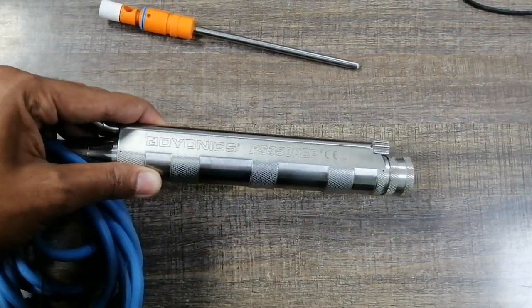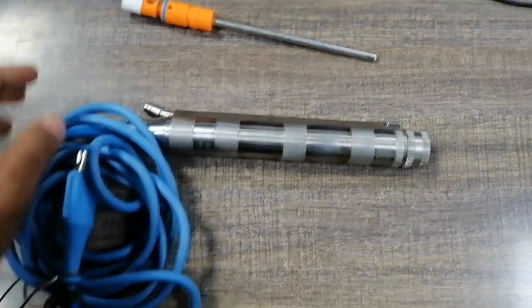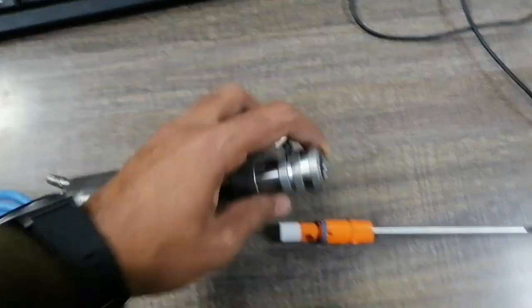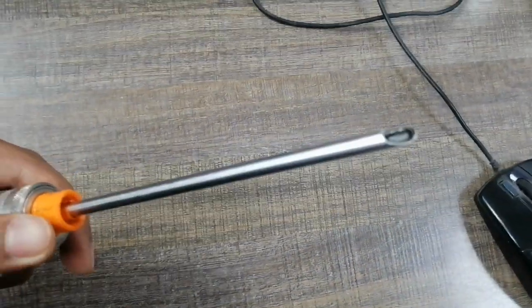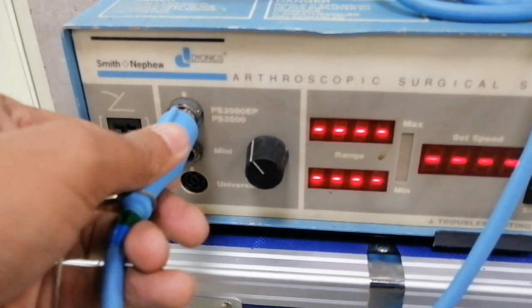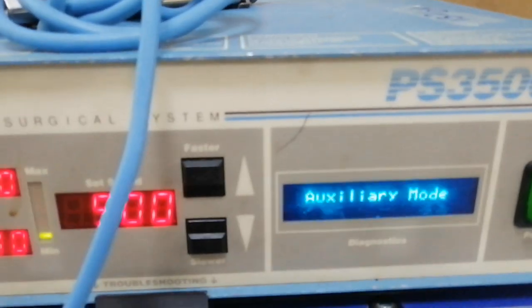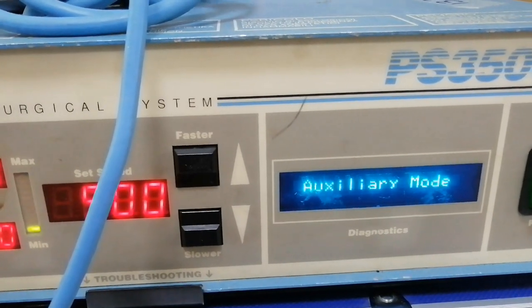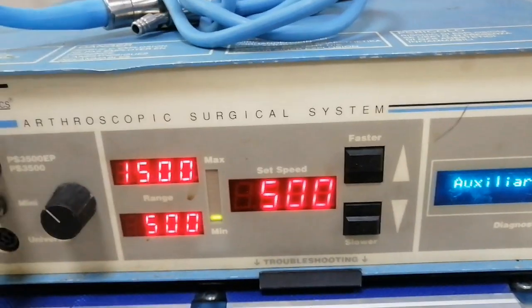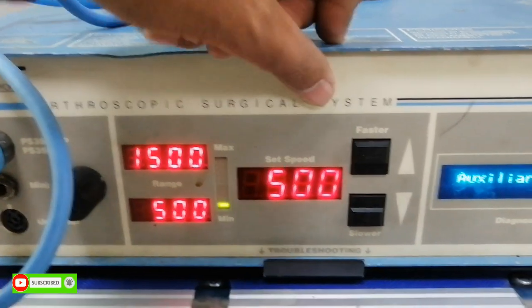This handpiece has the model number 3500 EP. This is the main connector of this unit, this is the burr which is replaceable, and this is the lock. When we connect the handpiece to the machine, the machine synchronizes the handpiece and displays speed settings such as 500, 1500, and 3500 RPM via the foot switch and the control buttons located on the handpiece.